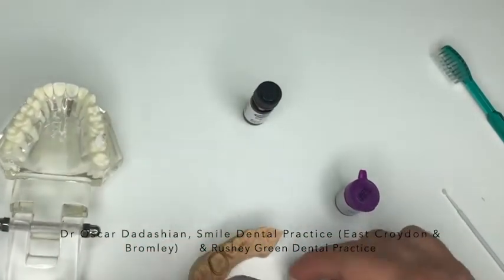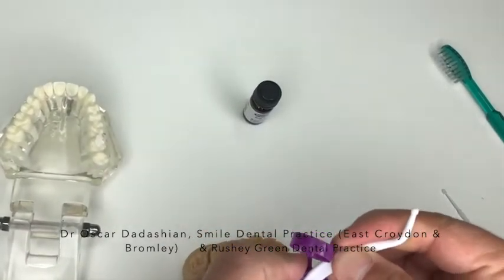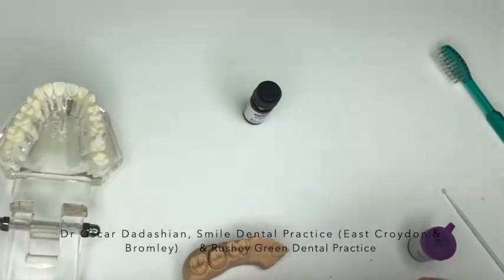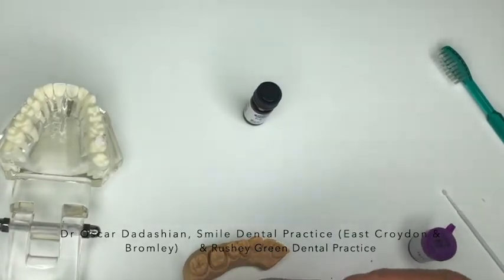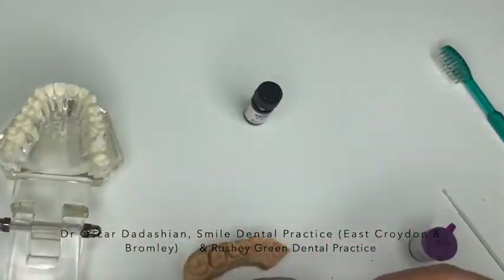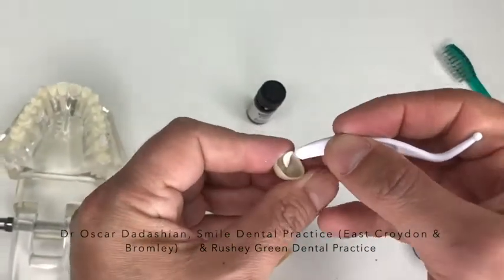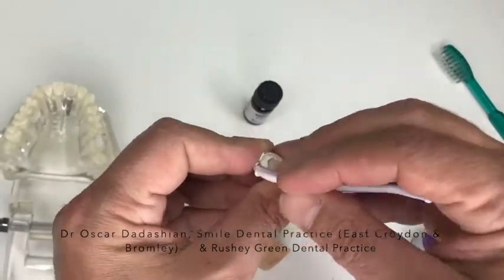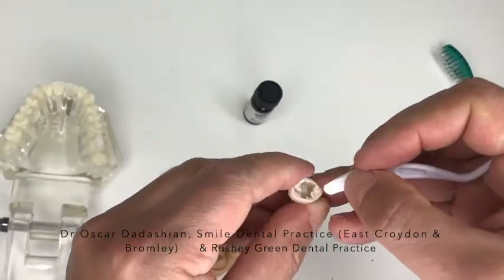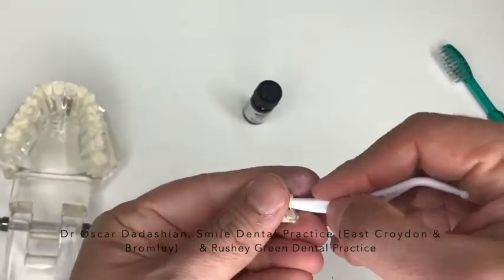So the way you do it is that you take again a piece of this temporary. You don't need to use that liquid anymore. You can, on the tooth itself, again, it will just make the tooth a little bit more comfortable, but you don't need to. I'm just making a little bowl or maybe a rice grain out of this, and I'm just going to put that inside. Once it's in there, I'm going to make sure that I spread this out. You don't need much. If you put in a lot of material, then it's going to be hard to keep it clean. So make sure you basically just spread it out, put a little bit everywhere.